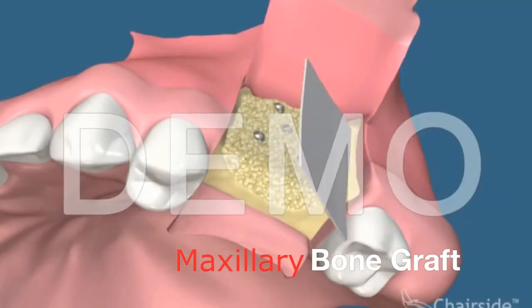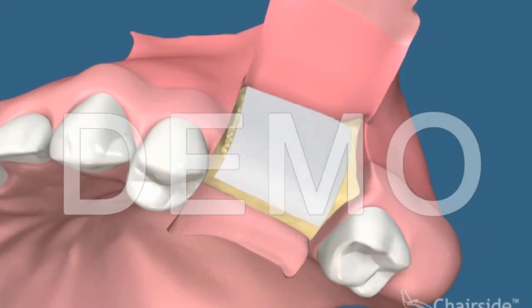The entire area is covered with a resorbable membrane to again prevent gum tissue ingrowth.